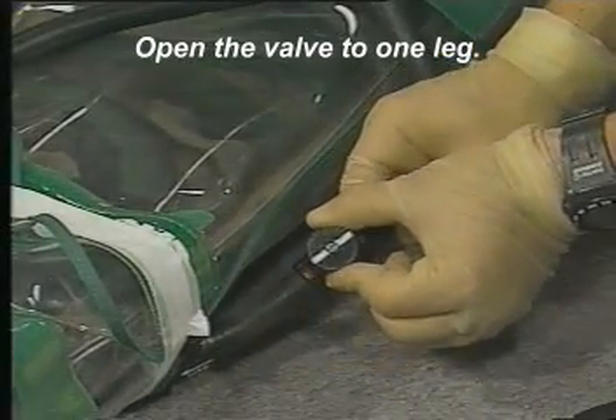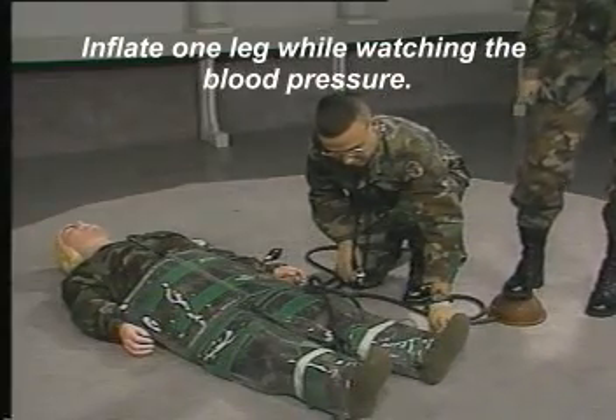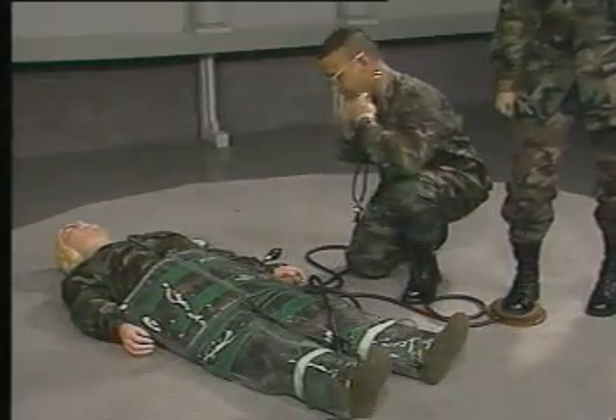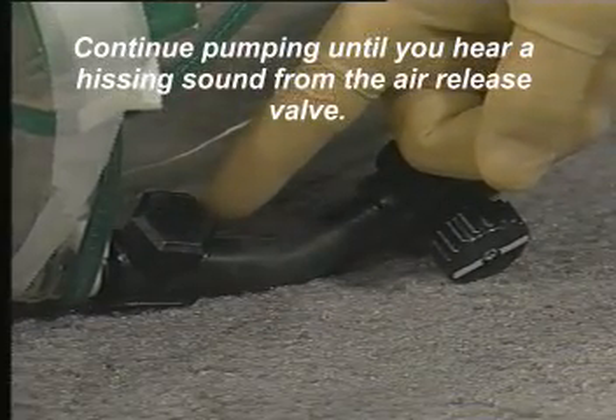Open the valve to one leg and inflate it while watching the blood pressure. Continue pumping until you hear a hissing sound from the air release valve.